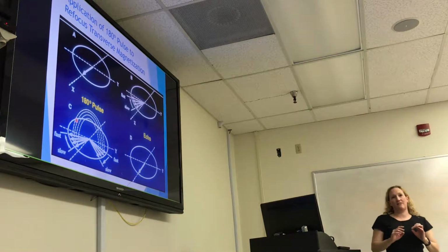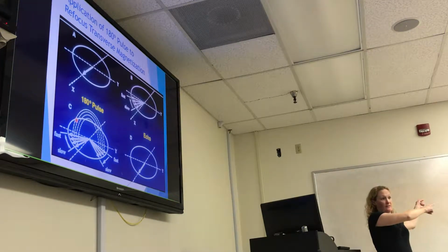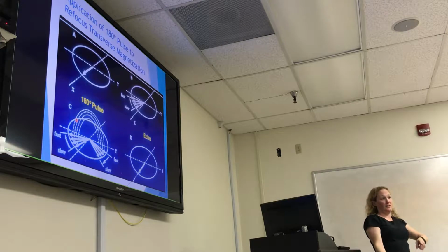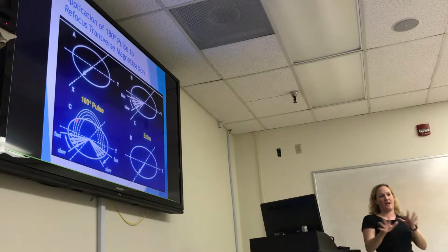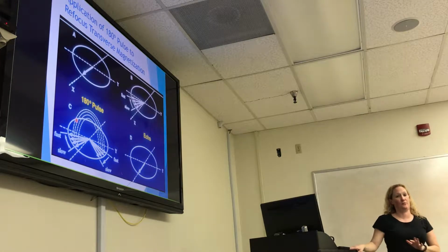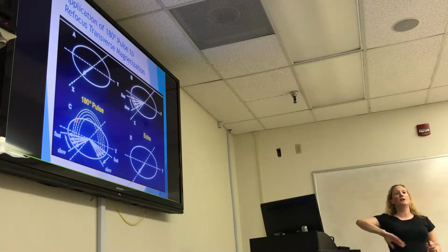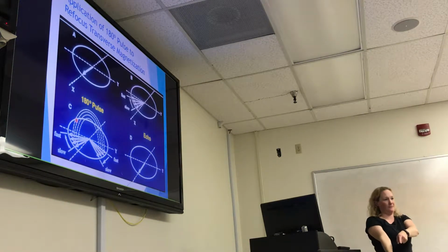When I say flip 180, let's say I'm spinning around like this, right? But I'm gonna freeze right here. 180 degrees from here is here, right? So I'm still in the transverse plane. I'm just flipped from here to here, okay? So hopefully that clears that up. Yes, when you flip it with the 180 degree pulse, you are still in the transverse plane. Now later we'll learn about another situation where that's not true, but for spin echo, the 180 pulse, you're still in the transverse plane. You're just on the opposite side of it, all right?